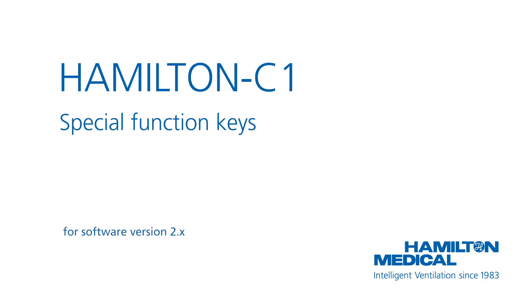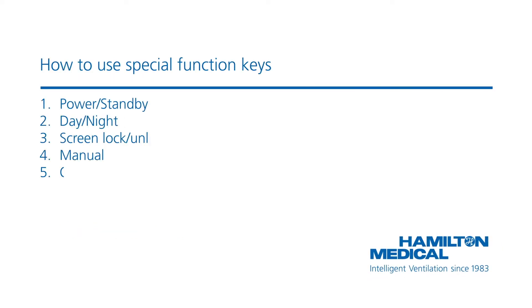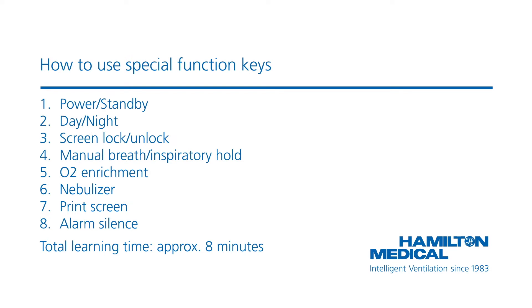This how-to video will show you the special function keys available on your Hamilton C1 and how to use them. You can use exactly the same information if you are operating a Hamilton T1 or Hamilton MR1 ventilator. The keys on the front of the ventilator give you access to some important functions, including entering standby mode and pausing the audible alarm. You should be able to complete the whole module in less than 8 minutes.